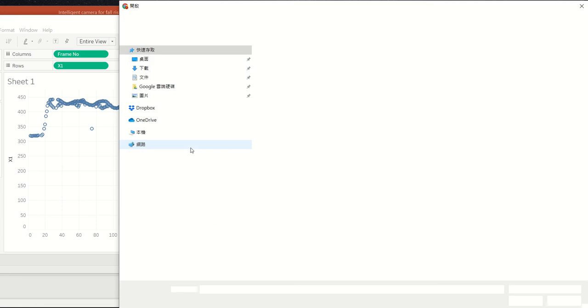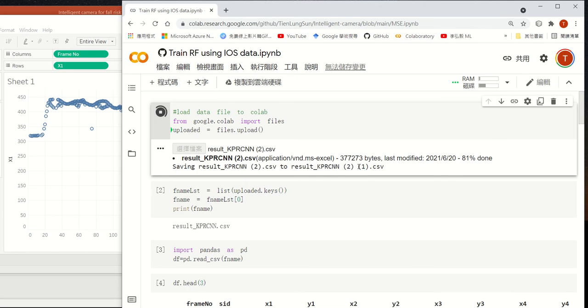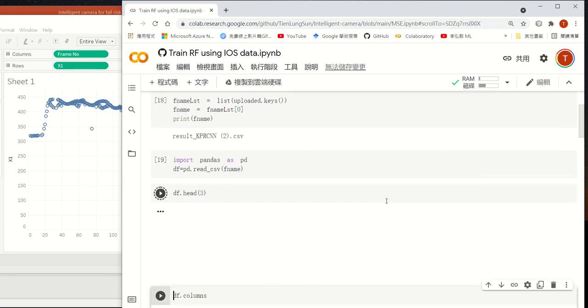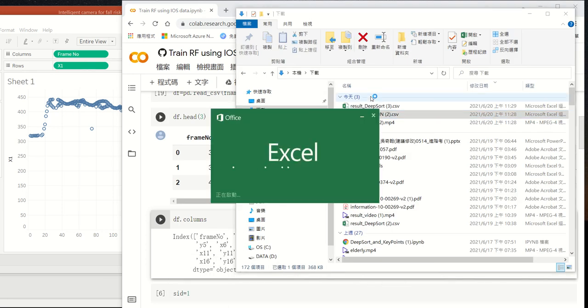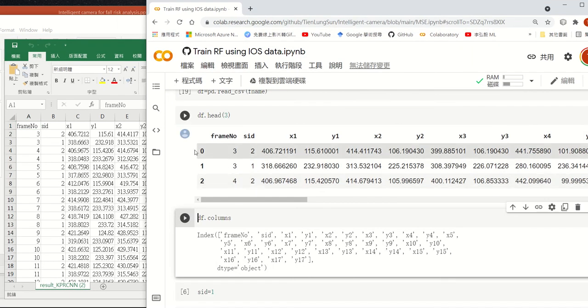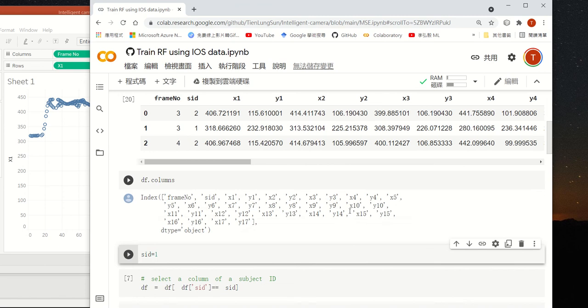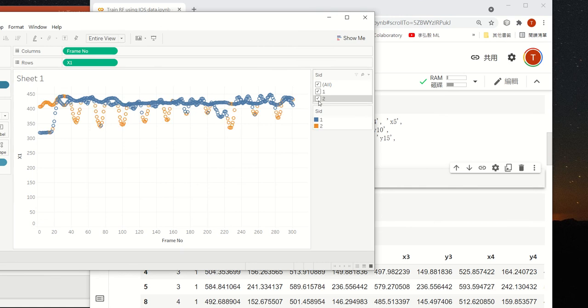Now we select, for example, the key points. We get the file name and use pandas to read it. Show the first 3 rows. It has frame number, subject ID, X1. You might check this by yourself. Show all the columns, and we want to look at subject 1 or subject 2 or all of them. In this example, I want to analyze X1.